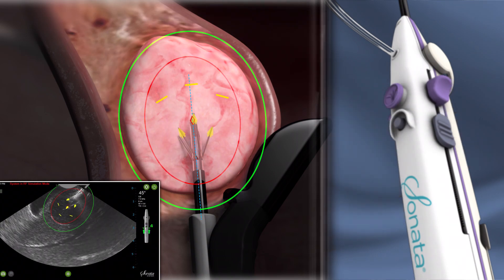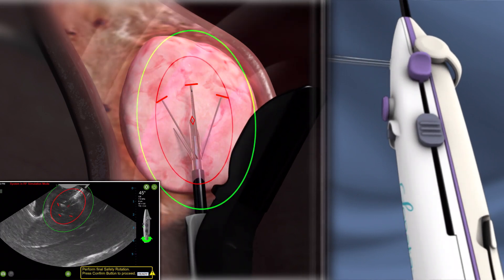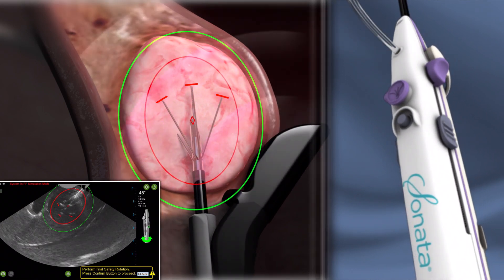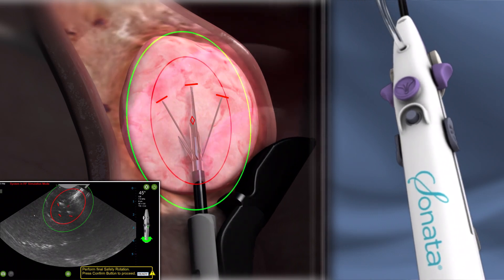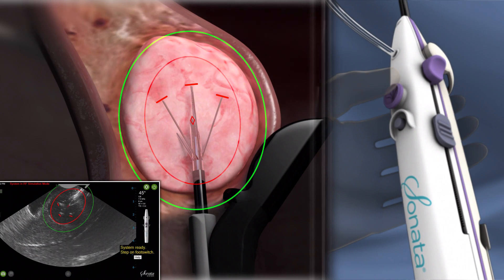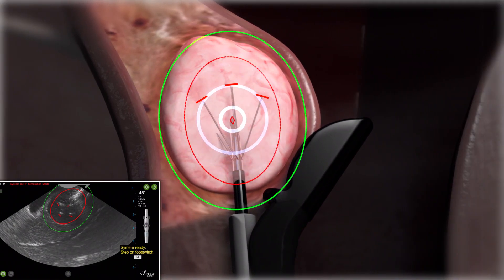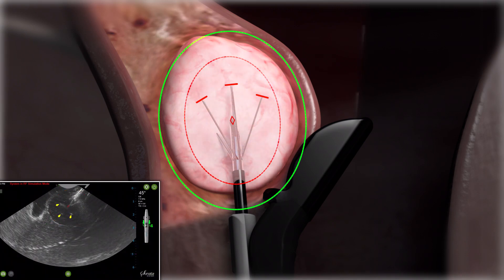Needle electrodes are deployed into the fibroid and the treatment device is rotated again to confirm safety. Radiofrequency energy is delivered. Ablation times range from 1 to 7 minutes depending on the size of the fibroid.